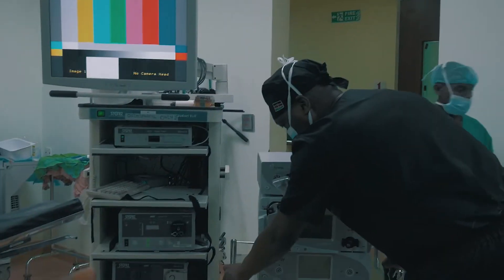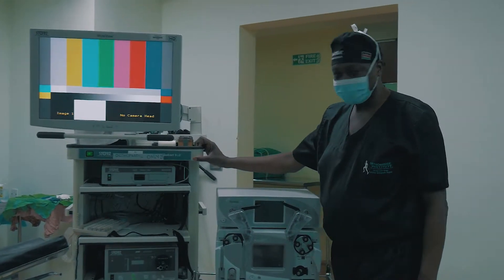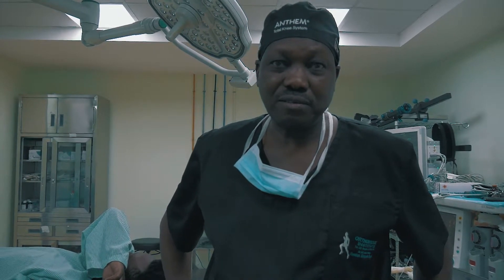We have examined him and today we have prepared him for surgery — the reconstruction of a new ligament. We are going to show you some of the tests that are commonly done to confirm that the patient has sustained an anterior cruciate ligament injury.